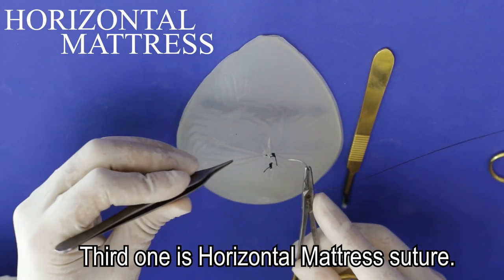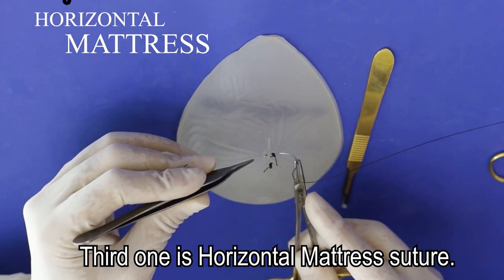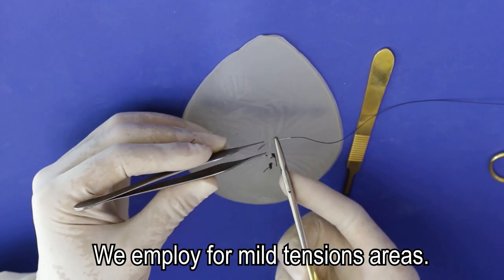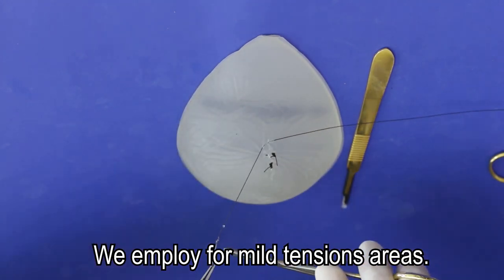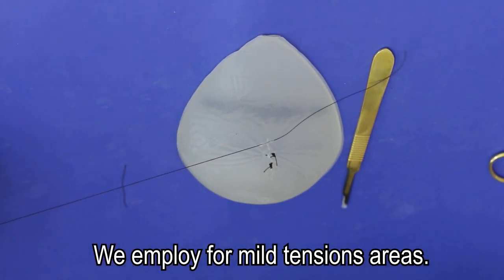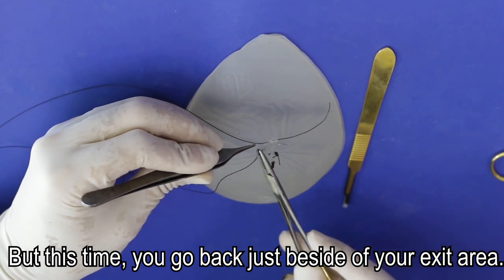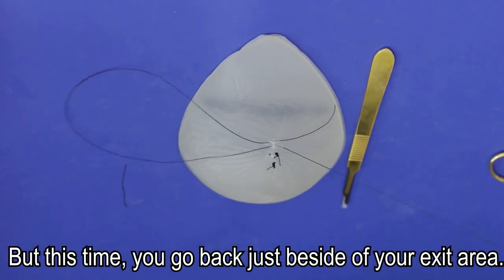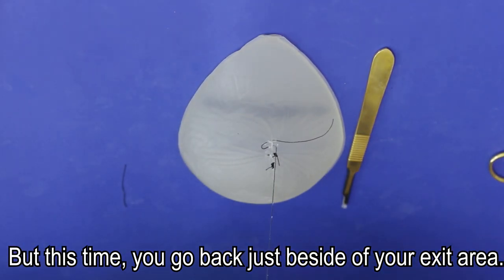Third one is the horizontal mattress suture. We employ it for mild tension areas. But this time, you go back just beside your exit area.